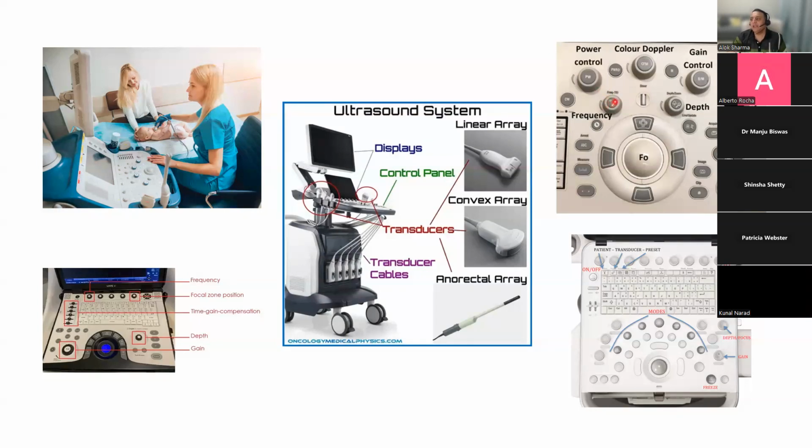But experience says that once you've set the frequency, the next step is setting your depth. And in term babies, we normally set depth to about 7 centimeters. But in preterm babies, you'll need to adjust. And an extremely preterm 400-gram baby may not just need adjustment of depth, but may need a little bit of magnification as well, because you have a large curvilinear probe.